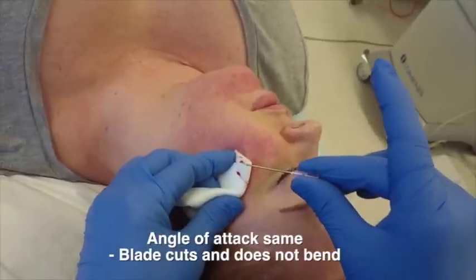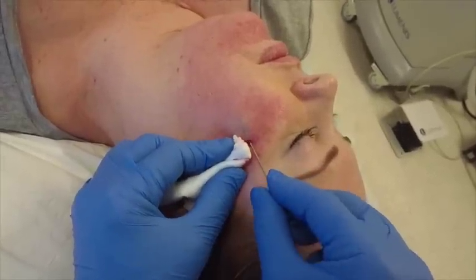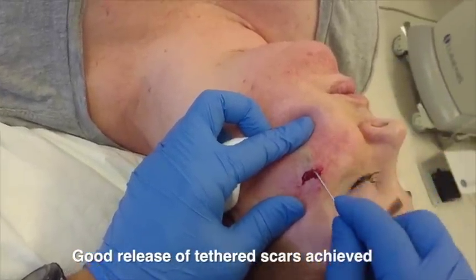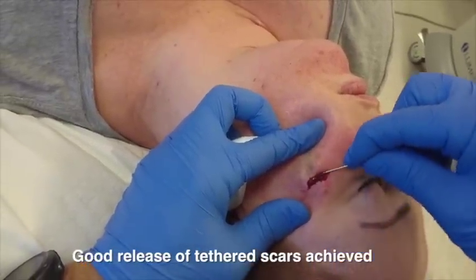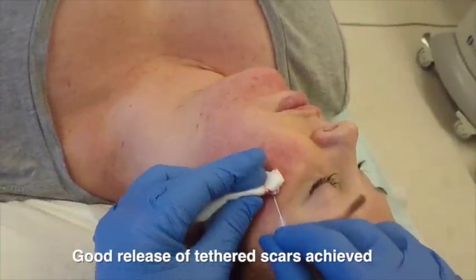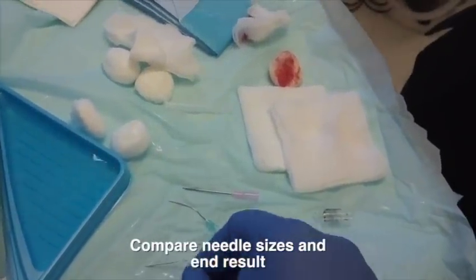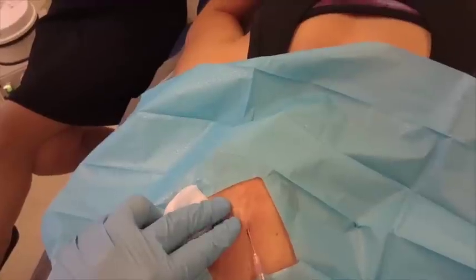That's why in my notes I've been writing down what's widely accepted by the community — namely my peers — which is basically the first method reported in 1995. This is a good release of tethered scars using a no-core needle. The downside is that there's a higher incidence of fibrosis and encapsulation with hematomas and seromas. You can compare the needle sizes and see that the no-core is not bent.